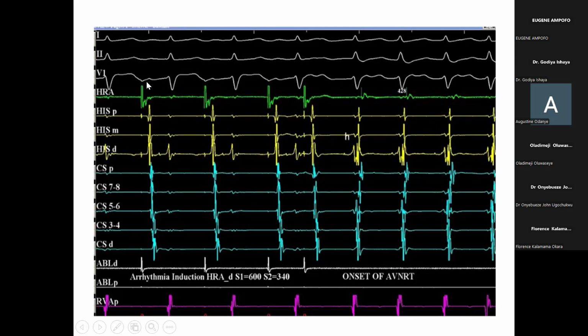If you are seeing your V waves, that means it corresponds closely. It might not fall at the same time, but it's going to correspond to the timing of the QRS, right? You get that? So your P, your QRS.